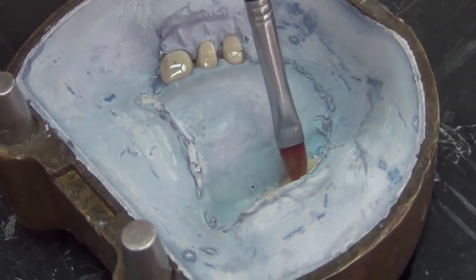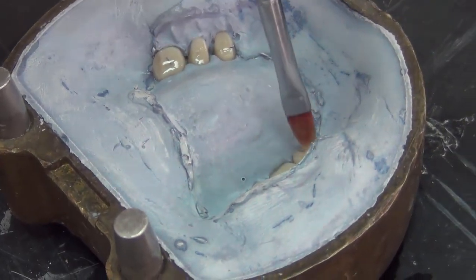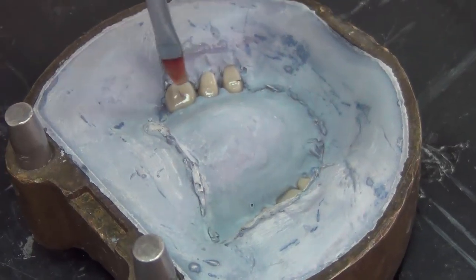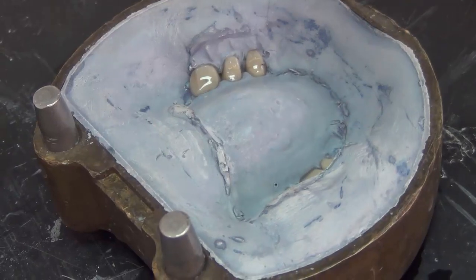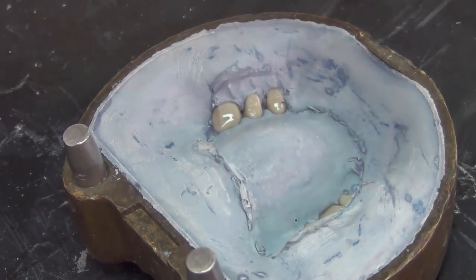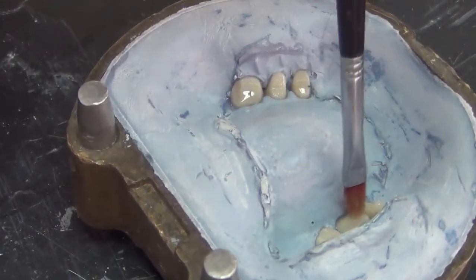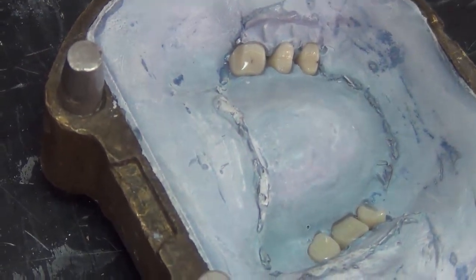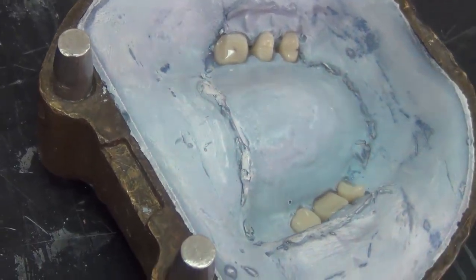multiple times, because I need them to really soak and penetrate into the acrylic. So even if this acrylic, you see it set, the monomer has the ability to interpenetrate the set acryl and soak it, and it will begin reaction from inside the tooth out and help the adhesion of the teeth to the new acrylic. Okay, and once it's dry, we're ready to do the acrylic.